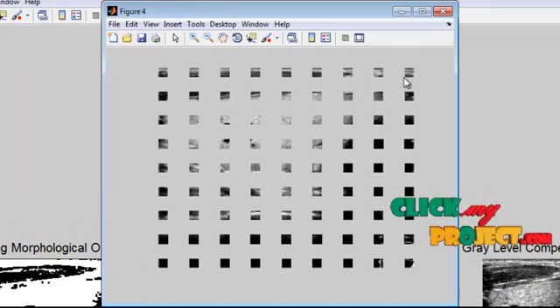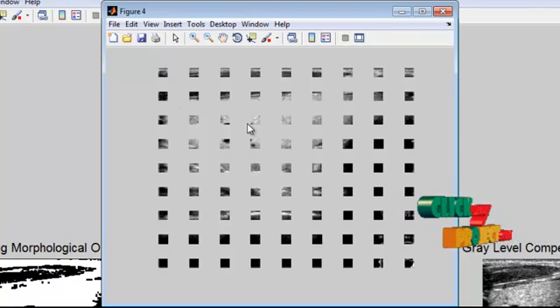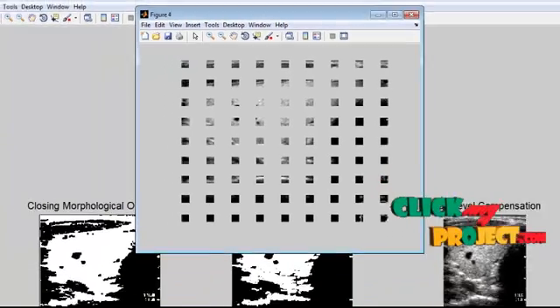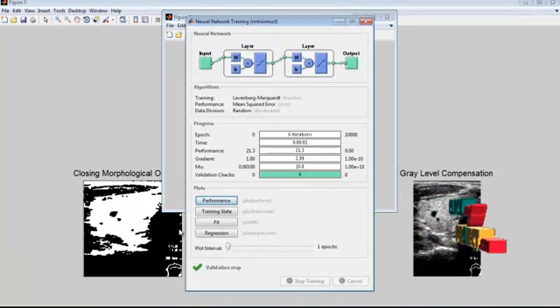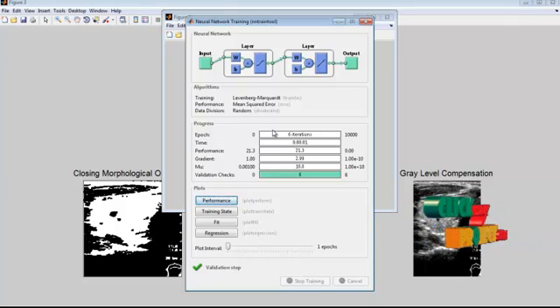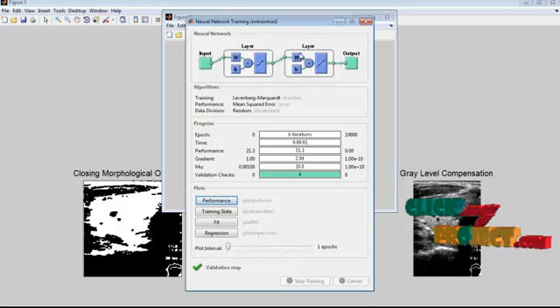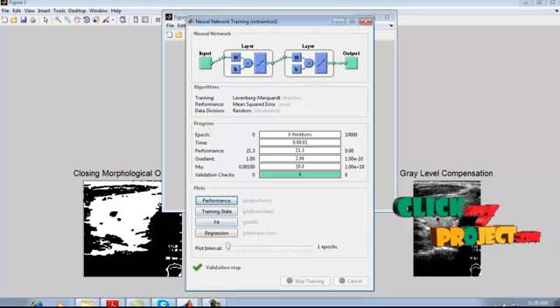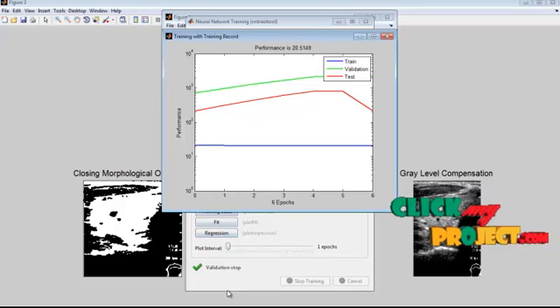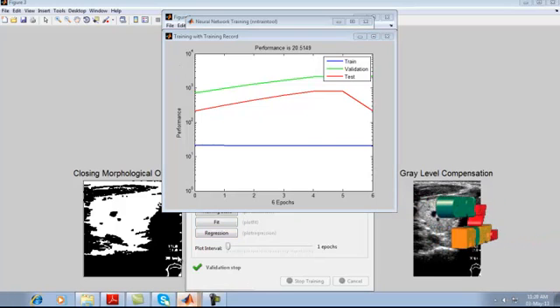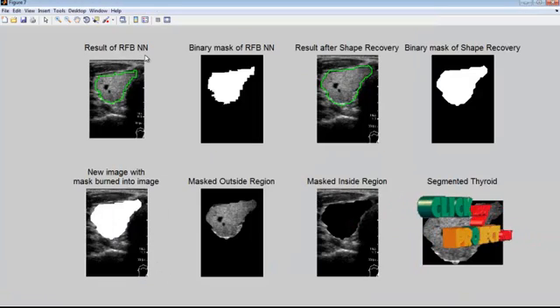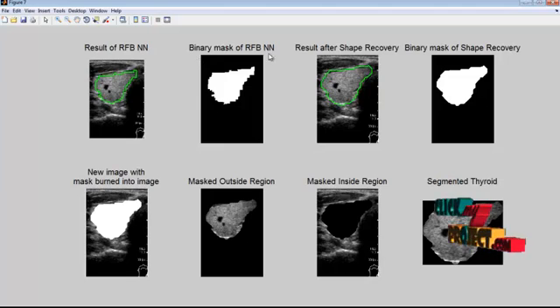This is the 9x9 block division applied to the image, from which features are extracted for each block. The normalized features are fed into the RBF neural network, and this shows the neural network training process along with its corresponding performance graph and regression graph. This is the result of the RBF neural network — we obtain the binary mask of the classified region.